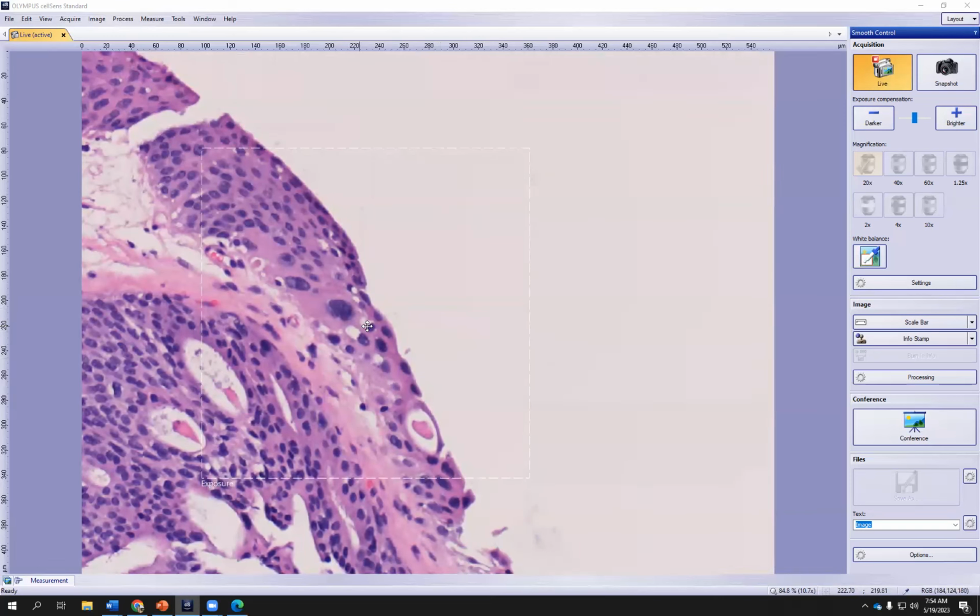And then the other feature is that the nuclei often have smudged chromatin. So you can see the smudgy, vague appearing nature of this chromatin over here compared to carcinoma in situ, where you find more often this vesicular or granular chromatin, right? And then the other feature is you don't really see nucleoli that are prominent in the degenerating umbrella cell. Okay, unlike carcinoma in situ in most cases.